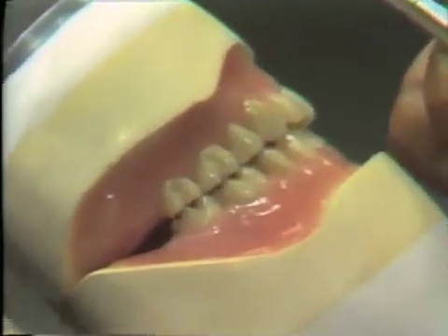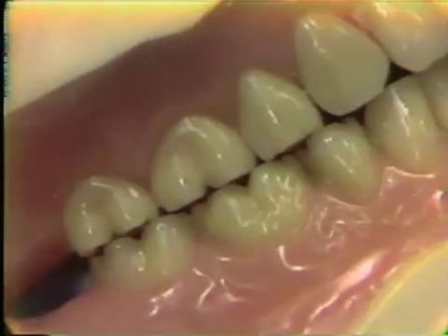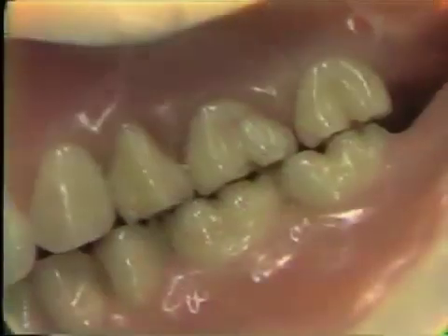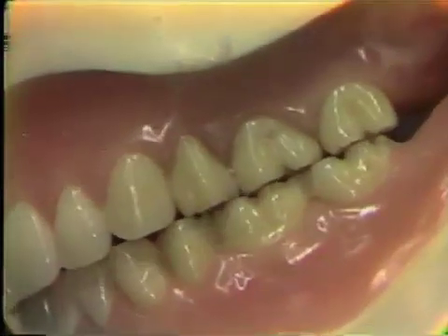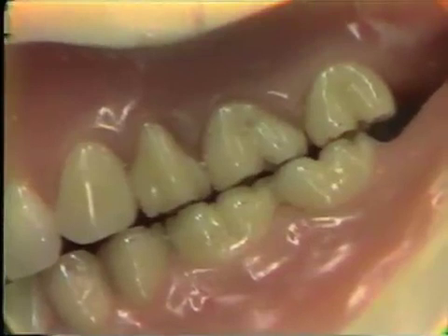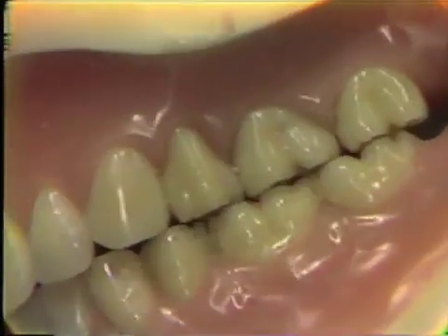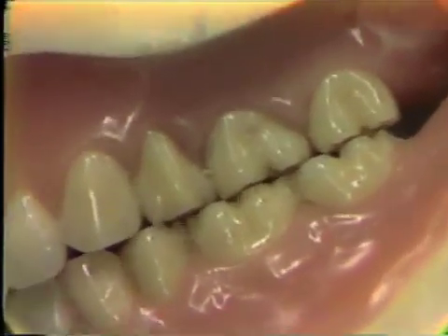In centric occlusion, on one side we have fairly close to a class I molar relationship, although with zero-degree teeth that is not necessary. On the opposite side we do not have the class I molar relationship — the maxillary molar is a little bit posterior. With the articulator loosened and moving into a balancing relationship, the potential for tooth contact exists. In the protrusive movement we are discluding slightly on the second molar, but it is certainly within the range of equilibration following processing. In the working relationship with zero-degree teeth, the buccal cusp of the maxillary tooth becomes the working cusp, and we are certainly within the range of adjustability.